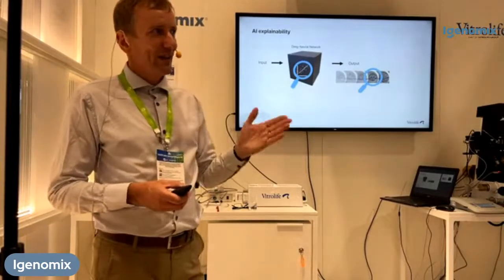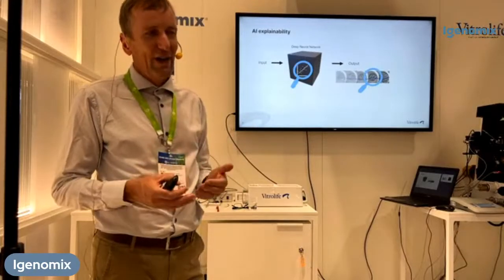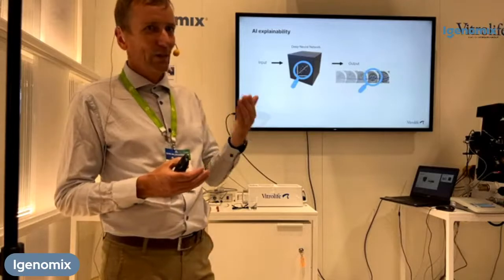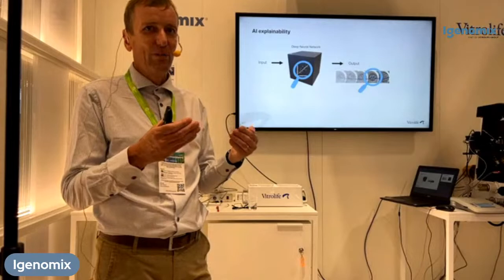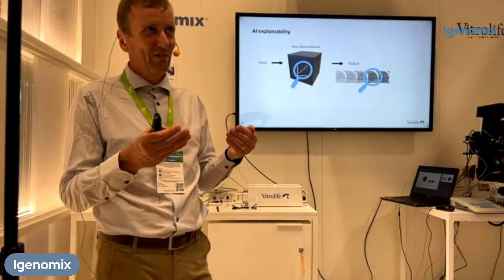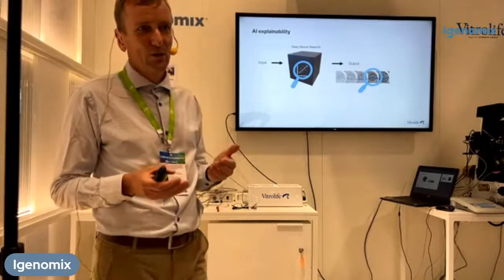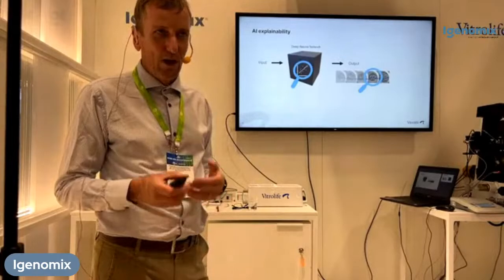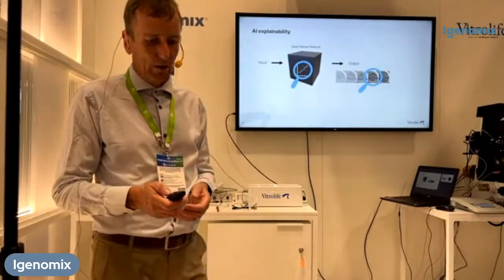There are a lot of studies that have investigated this, but I haven't seen any real evidence that you could have real explainability for every single score. That is, in my opinion, at least very difficult. So what I see today is that the only way we can really dig into how a model is performing is by looking at the overall performance of the model.